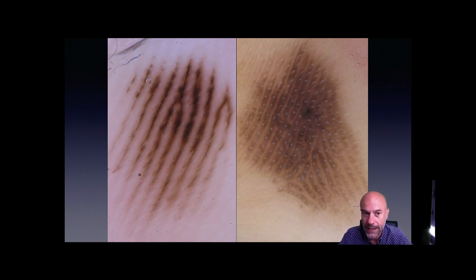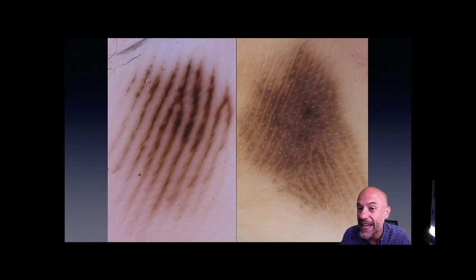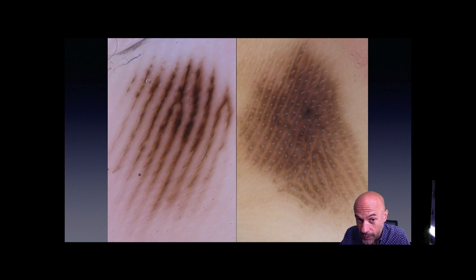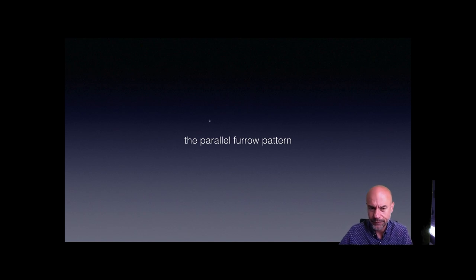Looking at real dermatoscopic images: parallel furrow pattern on the left — the pigmented lines are much thinner than the non-pigmented ones. On the right, parallel ridge pattern — the pigmented lines are much thicker. On the right, you can also see the eccrine duct openings on the pigmented lines. In the left image, the eccrine duct openings are located on the non-pigmented line. Parallel furrow pattern on the left, parallel ridge pattern on the right — this is very important basic knowledge.